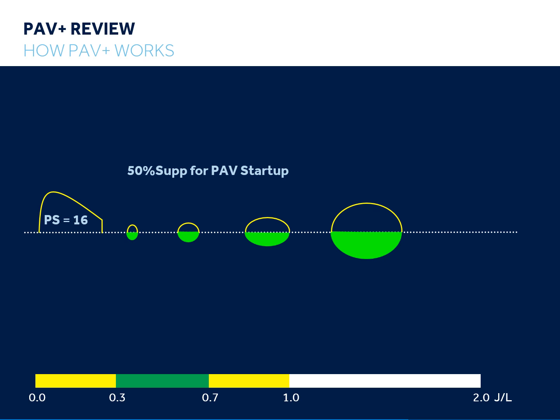As such, one may also extrapolate that the efforts made during pressure support are likely to be similar to the initial efforts made during proportional assist. This may be useful when assessing how strong the patient's efforts were in the previous mode.